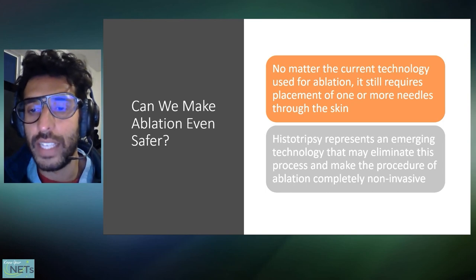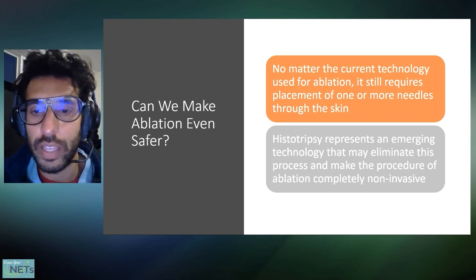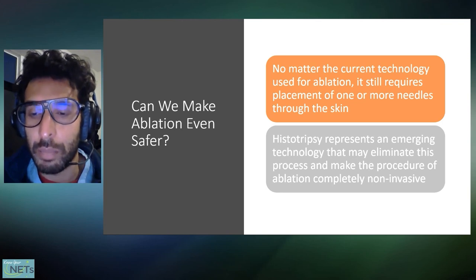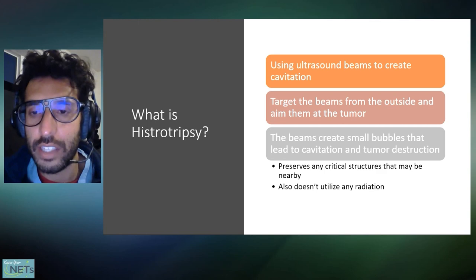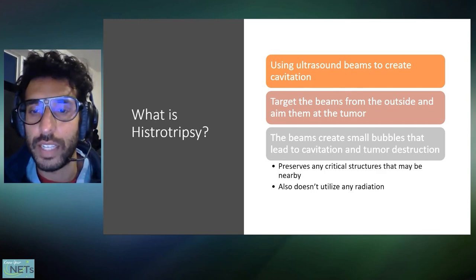And as minimally invasive as that is, it's still invasive. It still requires the skin to be broken. So there's a new technology known as histotripsy that we're really excited about that's emerging that may eliminate that process and actually make the procedure even safer and take a procedure from being minimally invasive to completely non-invasive. And it also has no radiation as well. So it's non-invasive and also non-radiative. So it's really sort of an attractive technology for that reason.